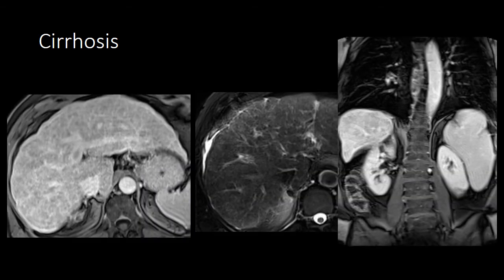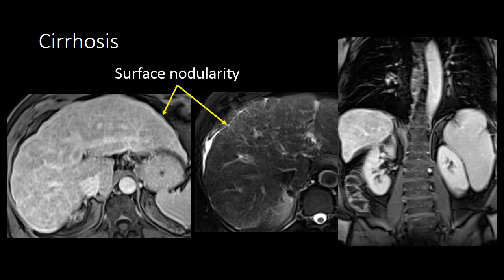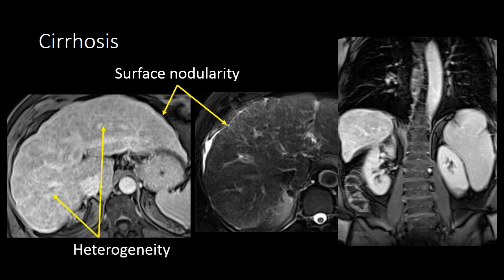When evaluating a patient for cirrhosis, the first thing we will look for is surface nodularity along the liver. The liver surface typically is smooth and does not have any waviness or nodularity to it. In these cases, we can see a wavy or nodular liver surface. We also look at the liver parenchyma, and in these cases the liver parenchyma is very heterogeneous.